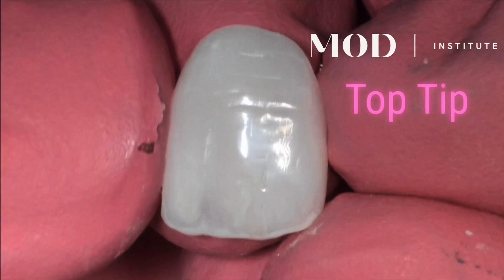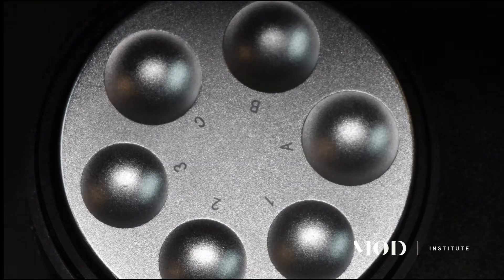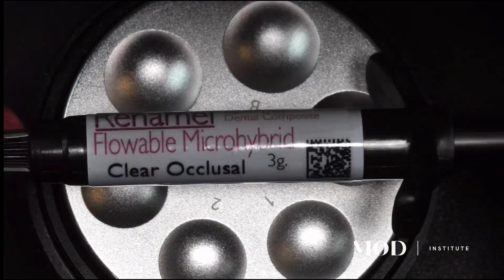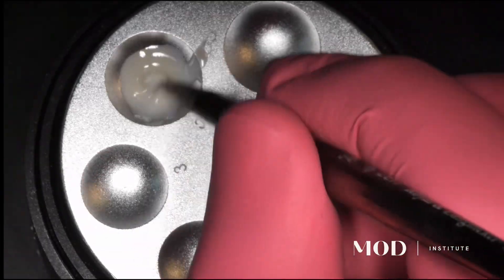Bomb-proof candy coating is absolutely something that can be done, and it can even be done chairside. Take flowable micro hybrid — in this particular case, this is Renamel Micro Hybrid. You could also do a micro fill, which would be even better.